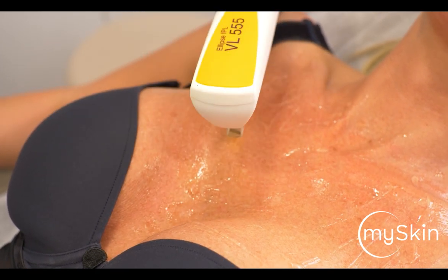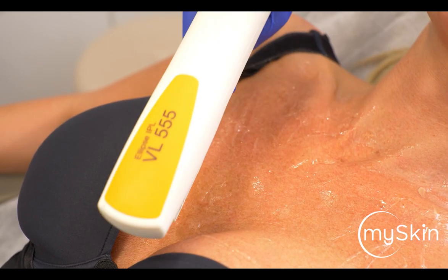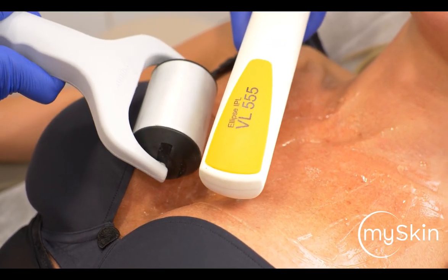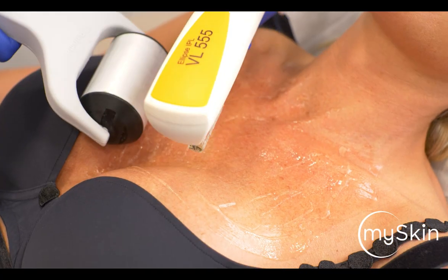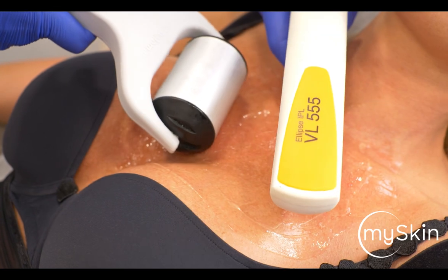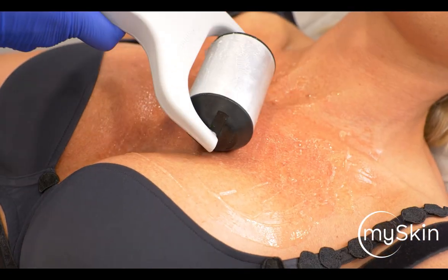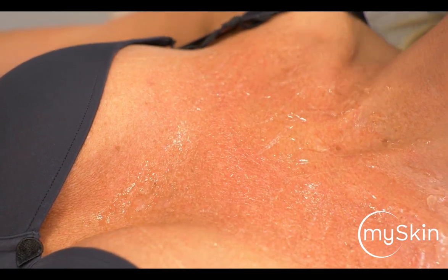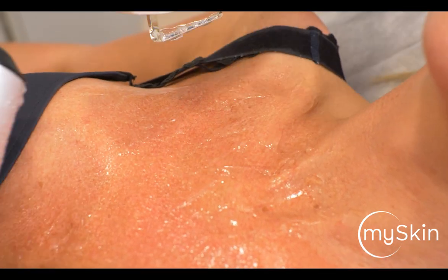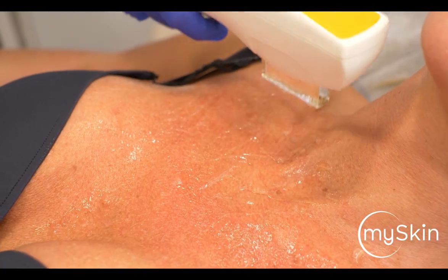Now I try to be quite quick. In the meantime, we can already cool the tissue and we start with one pass. I always advise my patients to let me know if they would like a break, but most patients prefer to be treated quickly. Now we need to be very careful because we reach the bony structures above the clavicle. On bone, we have a higher absorption of energy and heat, so I try to always be perpendicular to the bone so that we do not create too much heat with one shot.